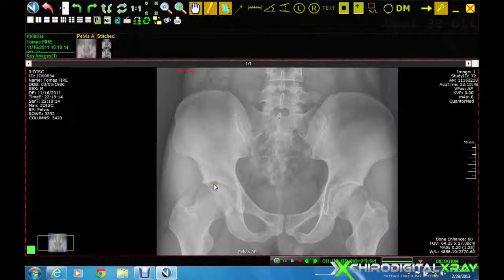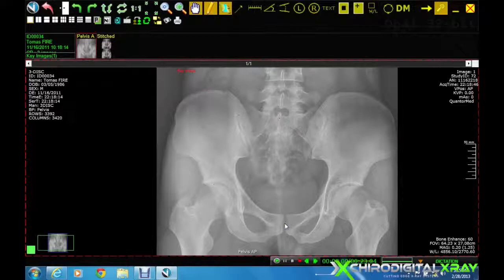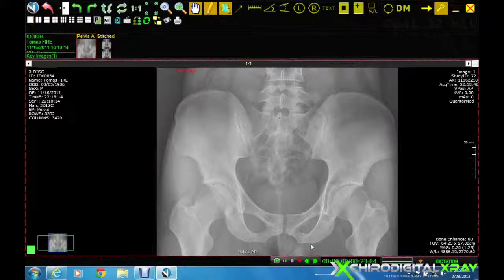Now to the top of the left femur head and the right femur head, the center of the symphysis pubis, the bottom of the left ischial tuberosity, and finally finishing with our final and sixteenth point at the bottom of the right ischial tuberosity.